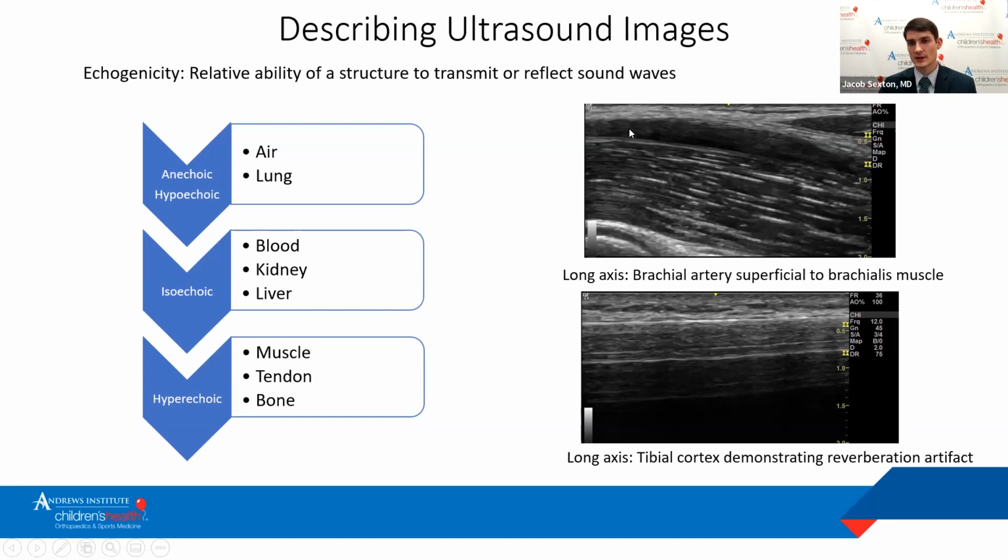So as you can see, this would be hypoechoic to this isoechoic gray area of the muscle. And then you have these white stripes coming in through here. This is adipose tissue within the muscle, which we'll talk about a little bit more in the lecture. And then further down here, you can even see the articular cartilage, which is hypoechoic, followed by the bony structure.